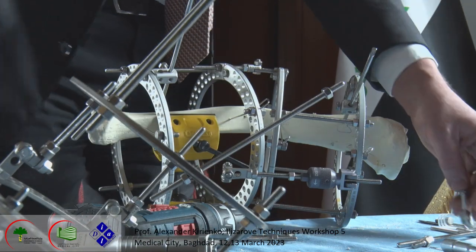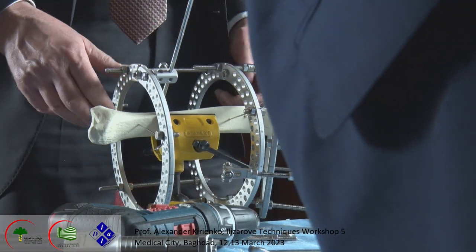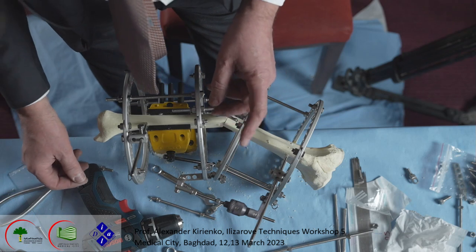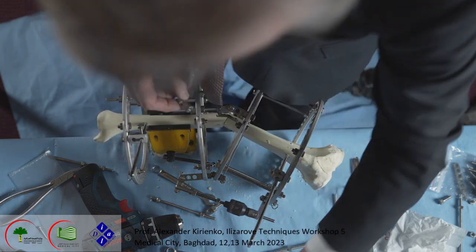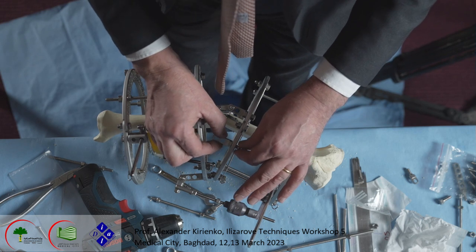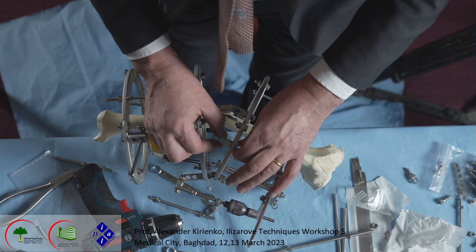See, I show you now this in the video. What we may do here, we use this two-hole post. We may put it here, for example, but like you see, we have really little space here.